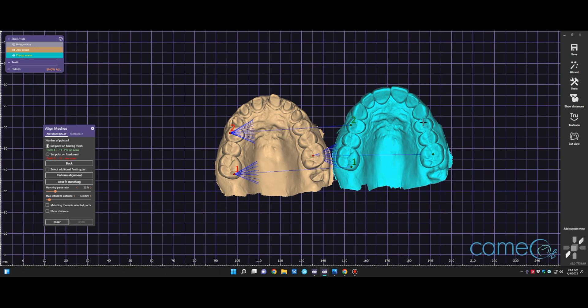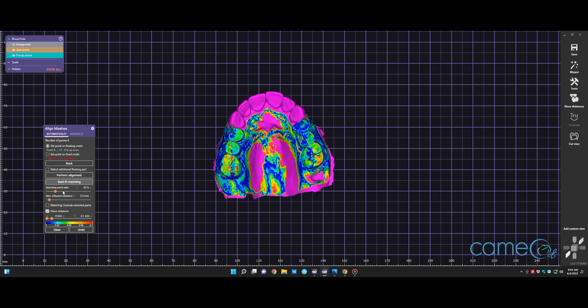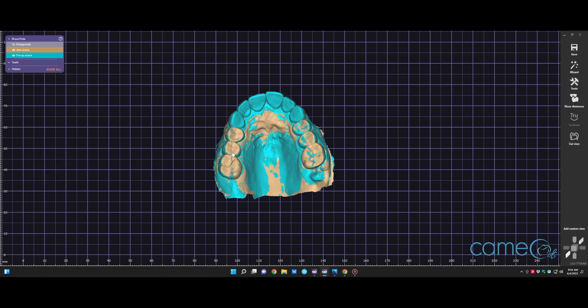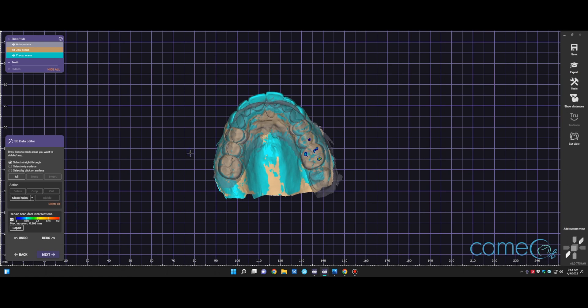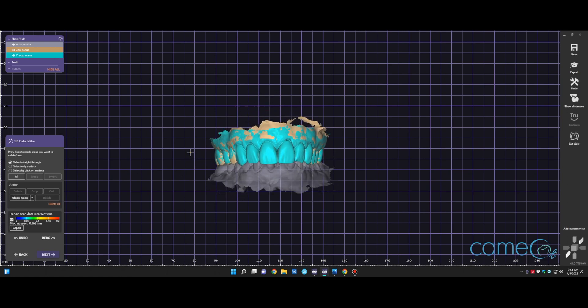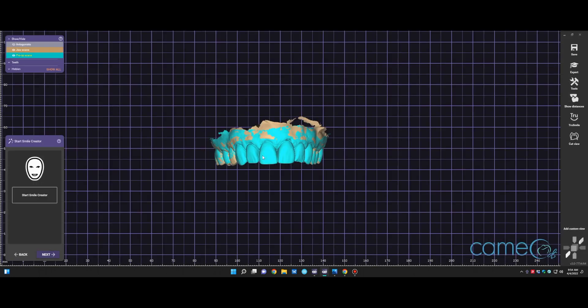And we'll perform an alignment. It'll line it up there. Okay, that's good. Then do the best fit matching. The best fit matching will correlate the scans the best that it's possible. So we liked it. Now we're going back to the wizard, and we can trim the scans if we'd like. We're not going to in this case, and we don't want to modify the scan data.